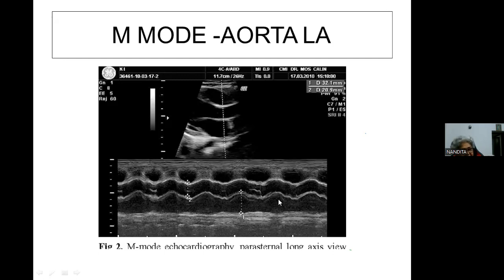Wait, sir will demonstrate. He will zoom in, make it big and show you, and then I think you will be more clear about it. Clarity will come to those who have not yet been clear about this. It's not clear to me also.